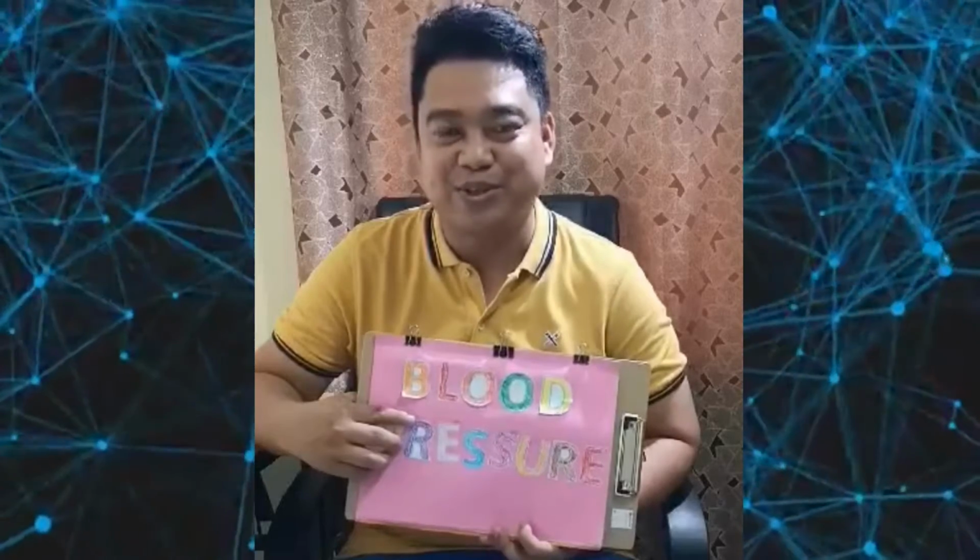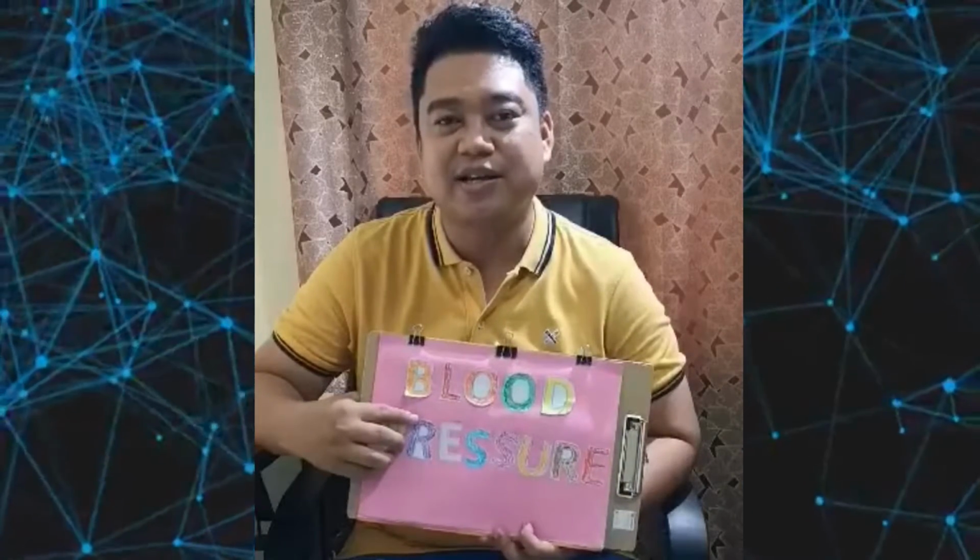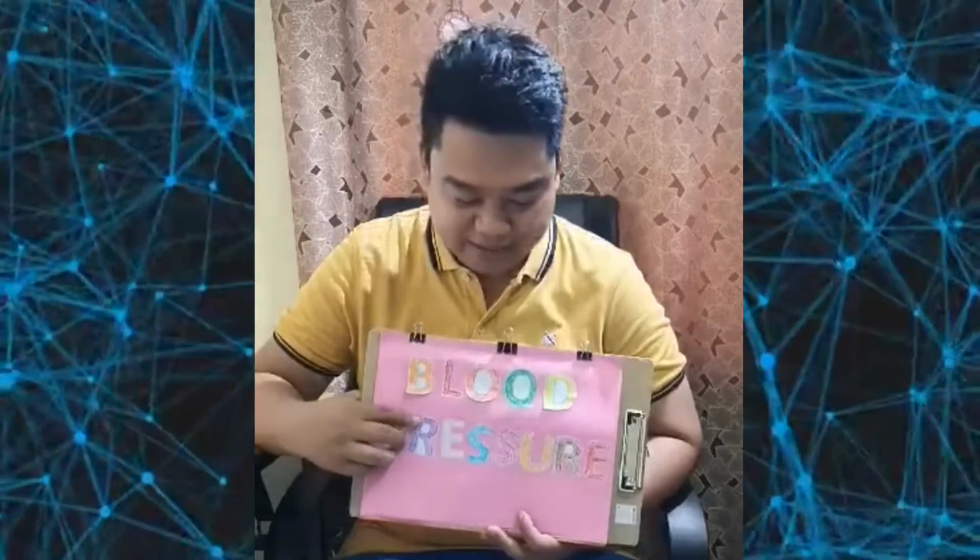And in today's discussion, we will be talking about blood pressure, and I'm going to demonstrate blood pressure monitoring. Okay? Now, the very objective of this discussion, class, is that at the end of the session, you will be able to know and understand the basic concepts about blood pressure, the circulatory system, and the functions of your heart, as well as identify the devices that we are going to use in monitoring the blood pressure of our patients. In this class, we will also demonstrate how to properly obtain the blood pressure of a patient. Okay? So let us proceed.